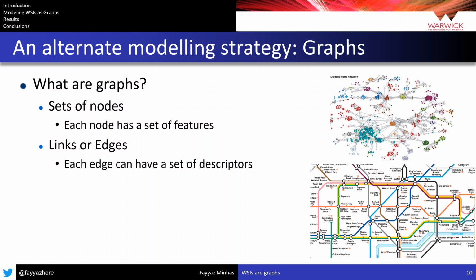So a single graph can be thought of as a set of nodes, each of them having a set of features, and we can have a set of edges, each of them having a set of features. And graphs have been used extensively ever since computer science has been in existence, and even before that. And we think that graphs can be a very natural way of modeling whole slide images as well.